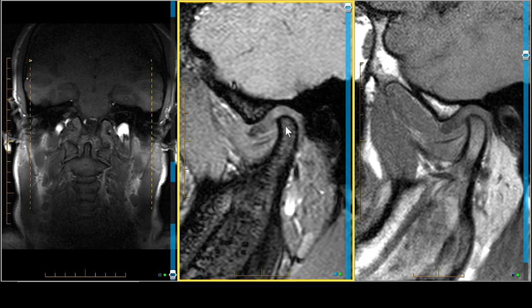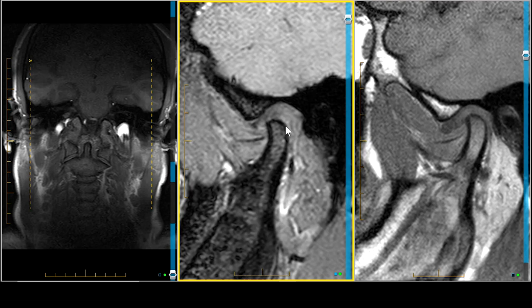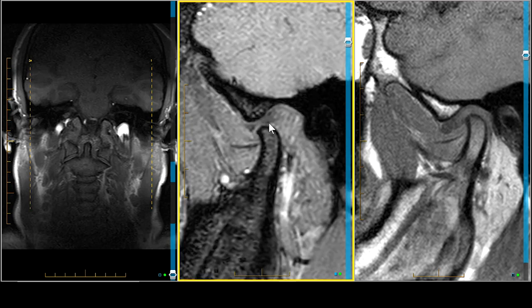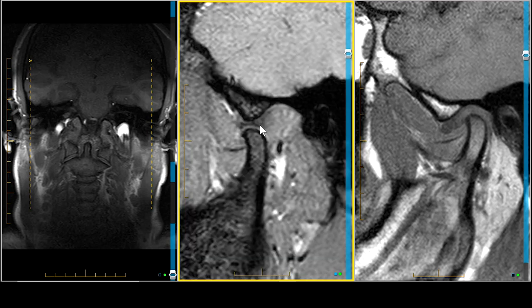Let's go to the open mouth view and see if those attachments show up and where our posterior band is. We're opening the incisors by using tongue depressors to separate the teeth. The condyle is rotating and translating forward — it's still moving forward — and now our posterior band is starting to take some shape, a lot like the bowtie that you would wear with your tuxedo. There's the right side of the bowtie, the left side — posterior and anterior with the intermediate zone.